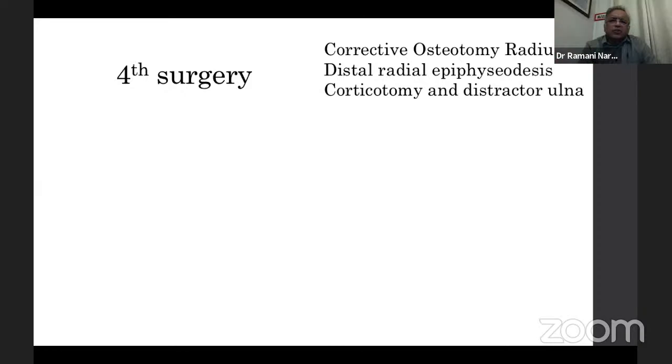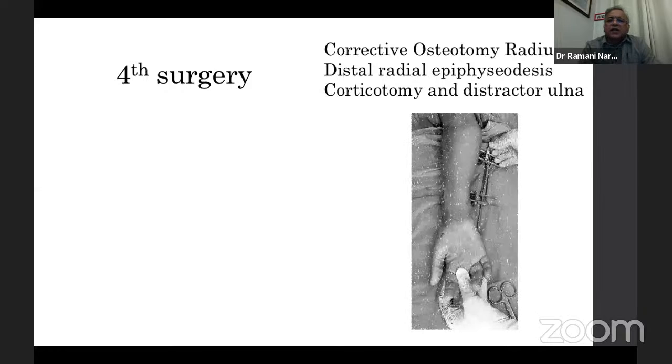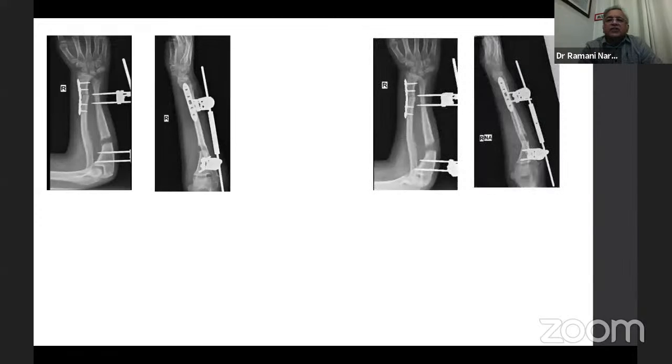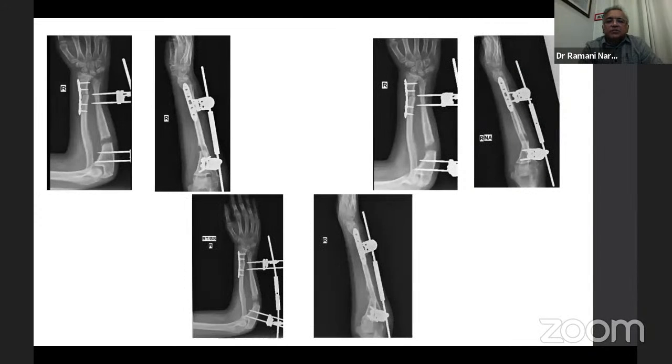We did a corrective osteotomy of the radius. We did a distal radial epiphyseodesis. We did a corticotomy and we had started distracting the ulna. See, this is the per-op picture. I have already done that radial corrective osteotomy. And this is how it started. He was 13 years then. And now we started distracting.